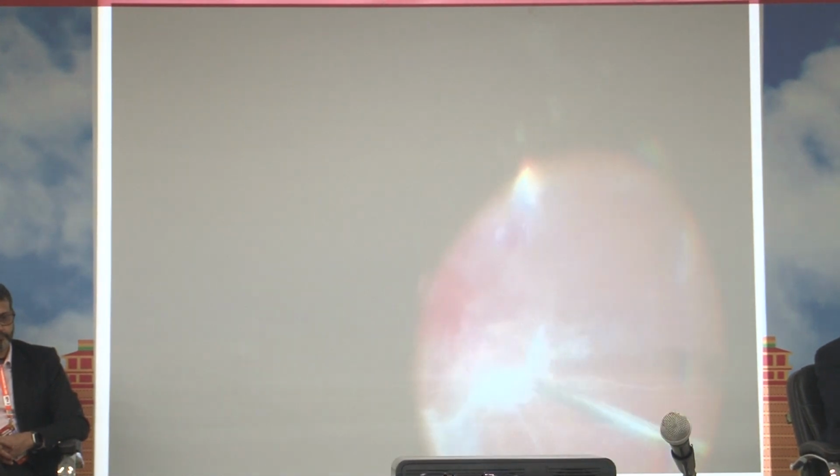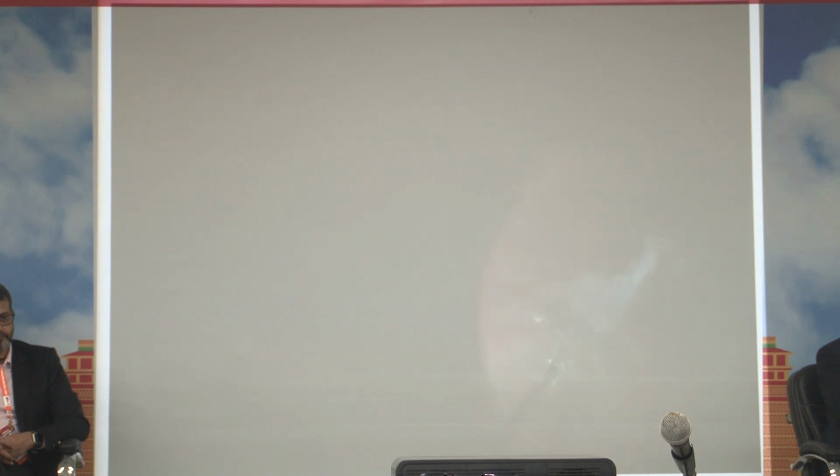But when it comes to the periphery, I don't think any surgeon hesitates to go bimanual, because you can see the periphery is pretty much sclerotic, with a very thin and necrotic retina. So I didn't want to take a chance with the help of the cutter itself. Here you are seeing the fold back delamination as described by Steve Charles. The key here is to remove as much membrane as possible up to the extreme periphery, because those are the chances where we go in for PVR.